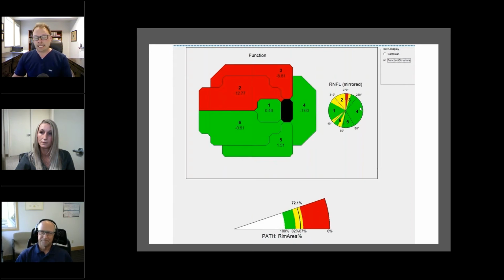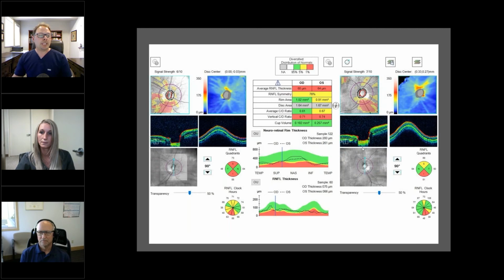So I glance at it typically, and then I look at the optic nerve and I look for a wedge defect in their fiber layer in that area. It oftentimes helps me find those little nerve fiber layer defects that would have been difficult otherwise. Interesting. Thanks.